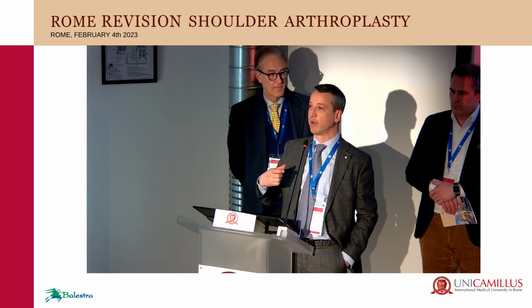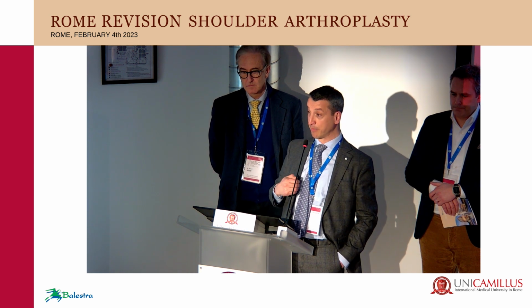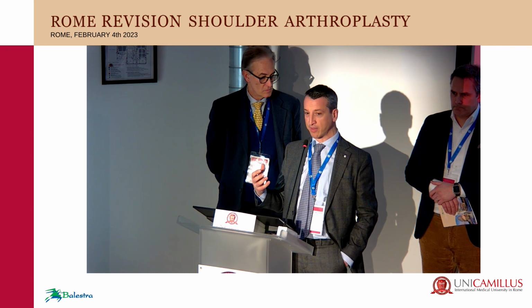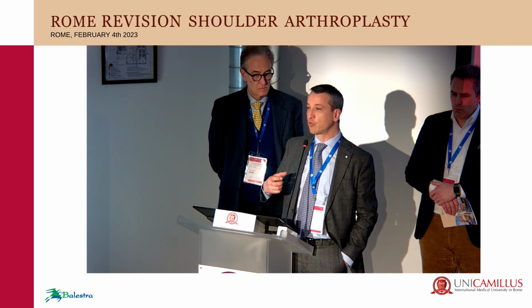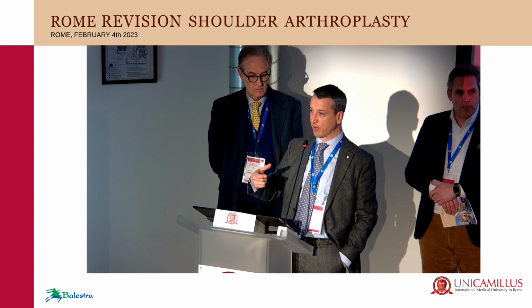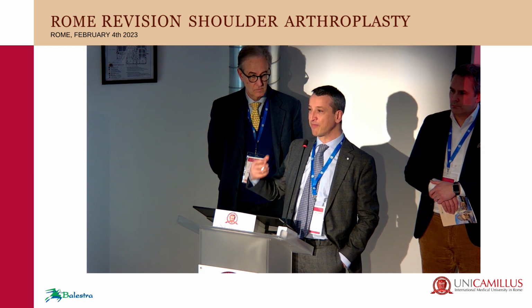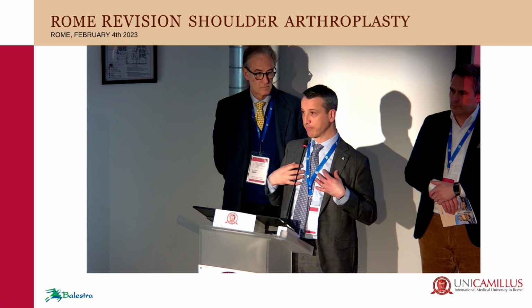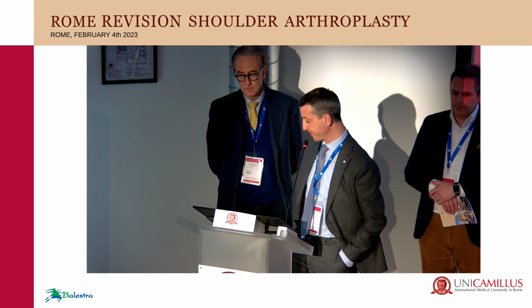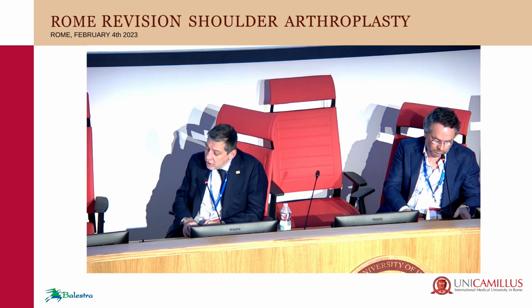You have to be able to posteriorly subluxate the humeral head, and it has to come back by itself. This is the trial we use to check the stability. If I have too much posterior instability, I try changing to a slightly bigger humeral head, and then I try the trial again. But if it's still unstable, and I'm quite sure about the correct position of the component, I switch to reverse.